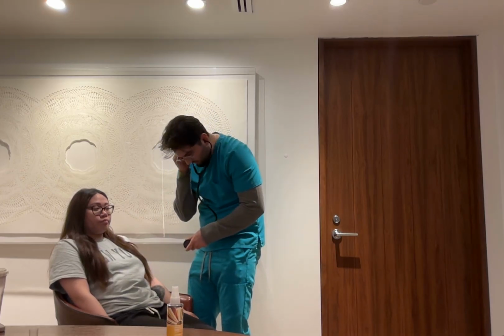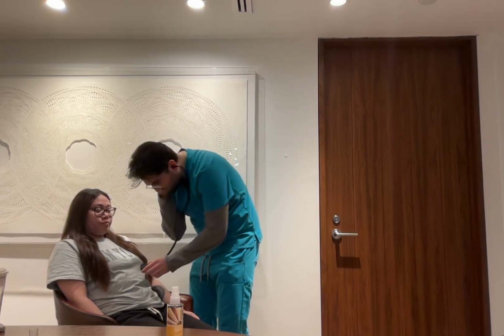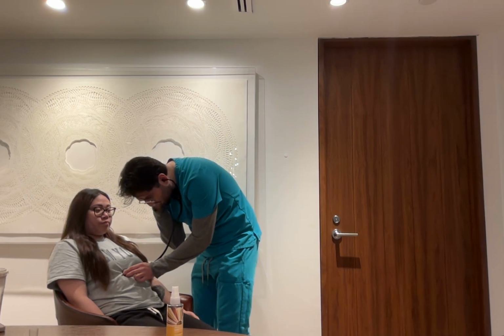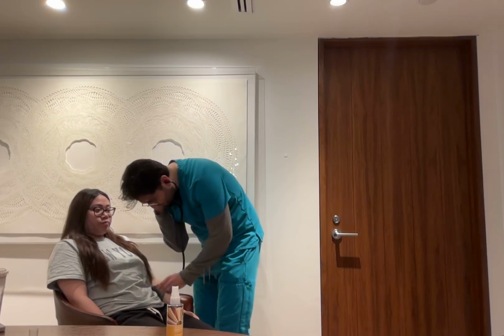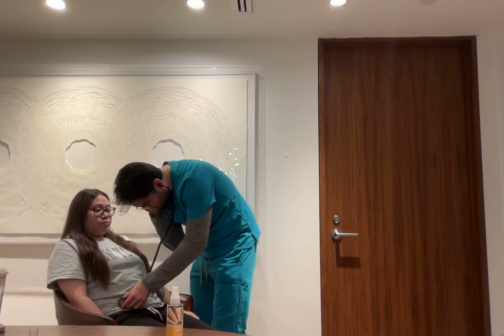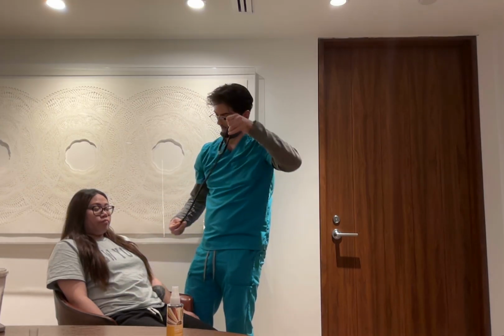Now I'm going to assess the major arteries in the abdomen with the bell of my stethoscope for any bruits, starting with the aorta, the right renal artery, the left renal artery, the left iliac artery, the right iliac artery. No bruits present in any of them.